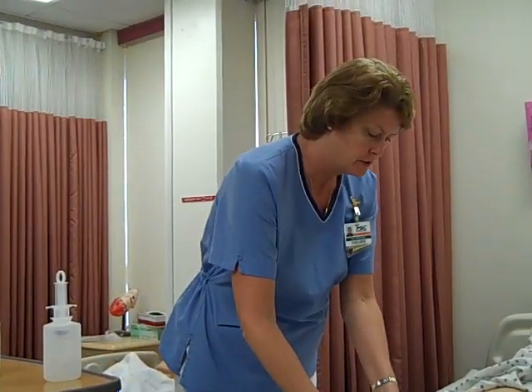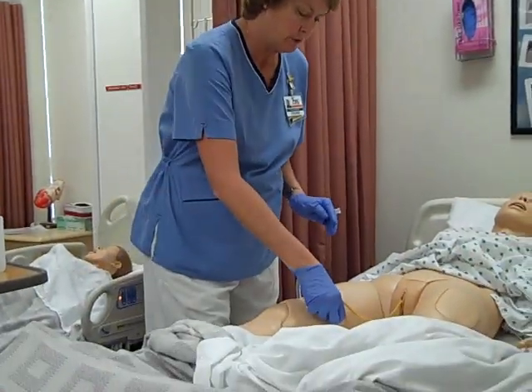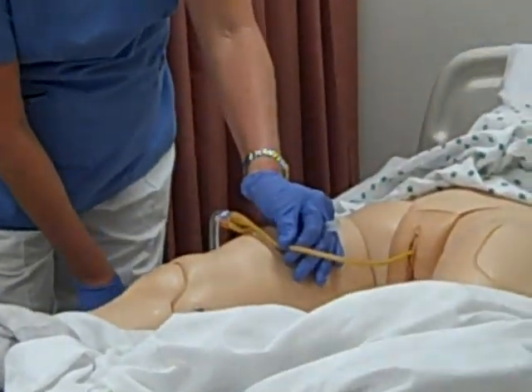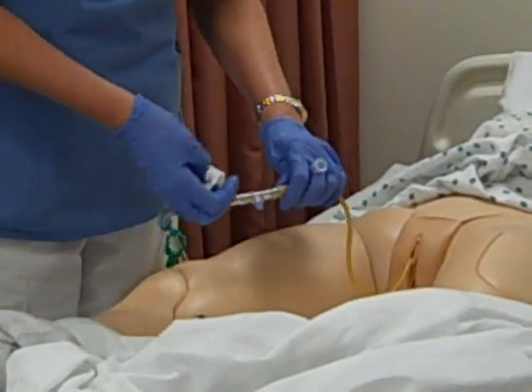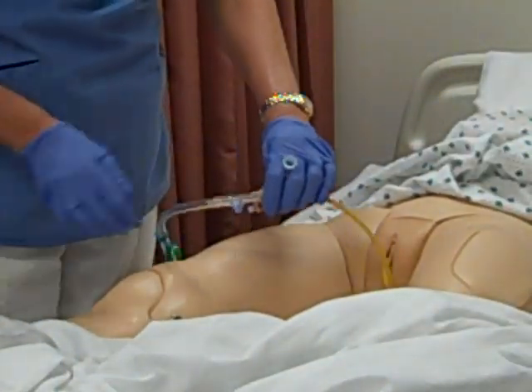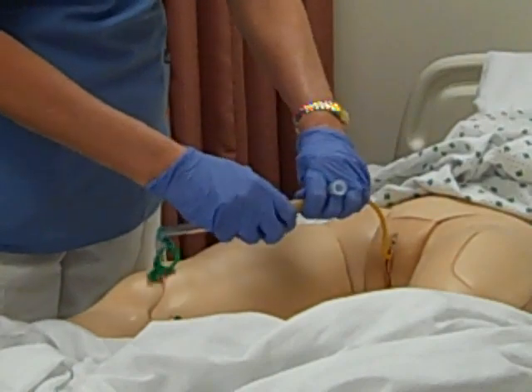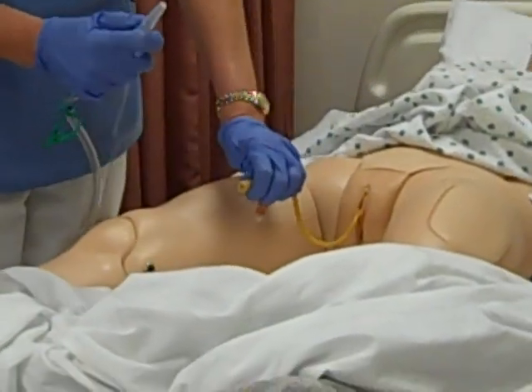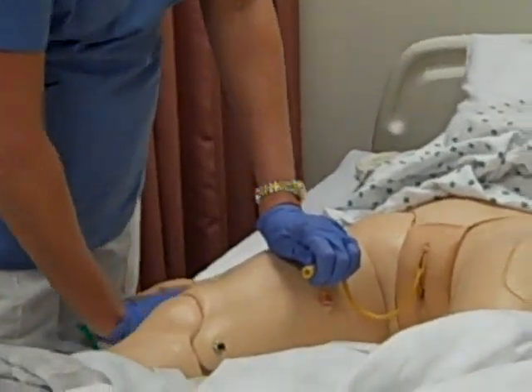Go ahead and set your tray down. We'll remove the tape from the patient's leg. Before you take this apart, you want to clean it off with alcohol, and then you can kind of clamp it off a little bit with your finger. We're going to take that apart and put the end of the drainage tubing onto the plug to keep that end sterile.